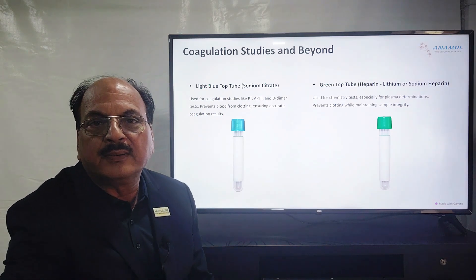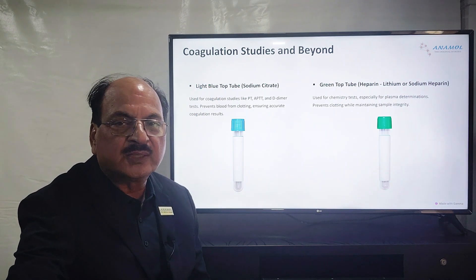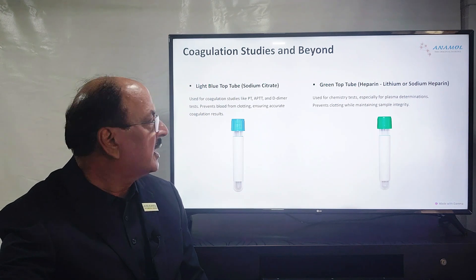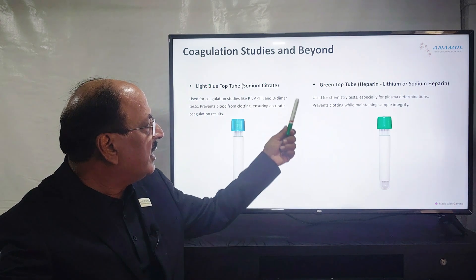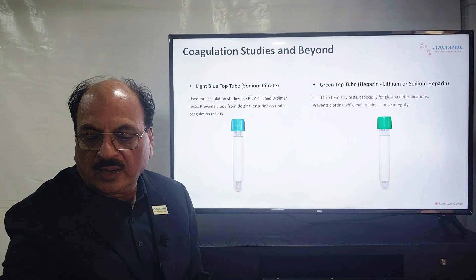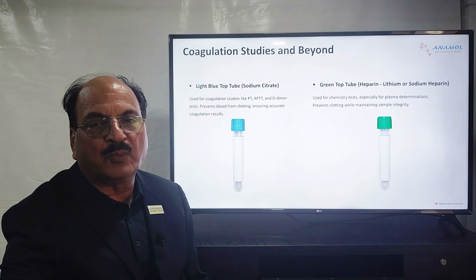There are 2 more colors: light blue and green. Light blue contains sodium citrate, which is an anticoagulant, and is used for whole blood collection. This whole blood is meant for prothrombin time (PT) and activated partial thromboplastin time (APTT). For biochemical analysis, the green tube contains heparin — either sodium salt or lithium salt — as an anticoagulant. The moment you collect blood in the green tube and centrifuge it, clotting does not occur, so you get cells at the bottom and plasma on top.